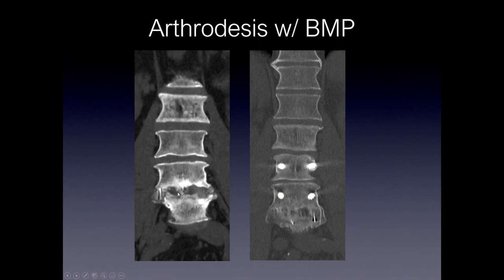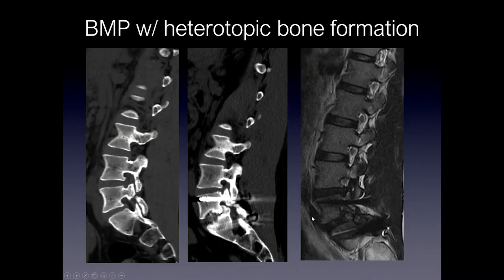Here's a patient who underwent two surgeries. The patient initially had a lumbar interbody fusion and bone morphogenetic protein was placed inside the disc space. The patient subsequently underwent a fusion, and along with the bone morphogenetic protein, you can see clear, robust fusion with bony bridging across this disc space.